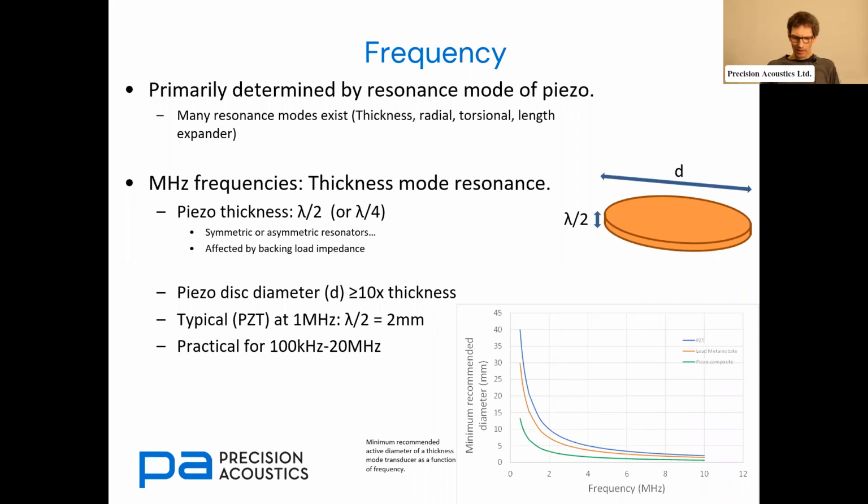Okay, thanks a lot. Maybe I have a quick question myself. I think some might be a little surprised about one of the initial examples you gave, that for this PVDF film of 9 micrometers, the diameter was affecting the frequency. Of course the thickness would clearly be affecting it, but the influence of diameter, I think, is through capacitance. Can you elaborate a little bit on this?